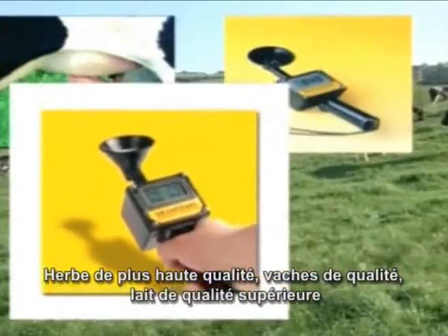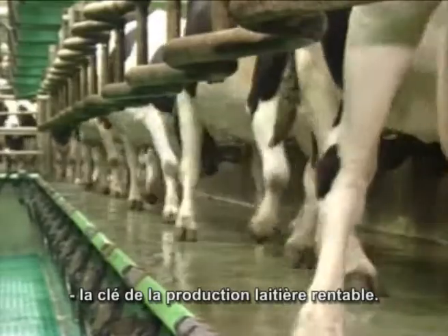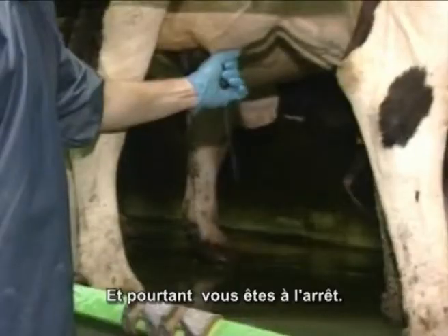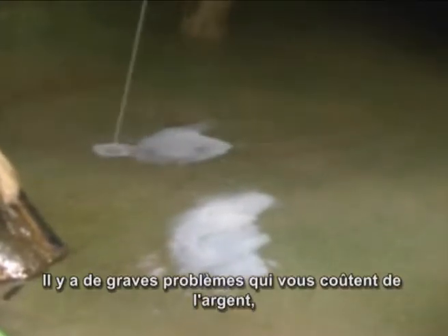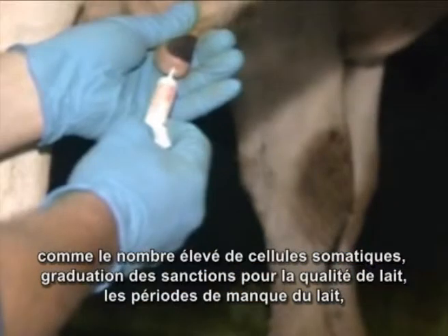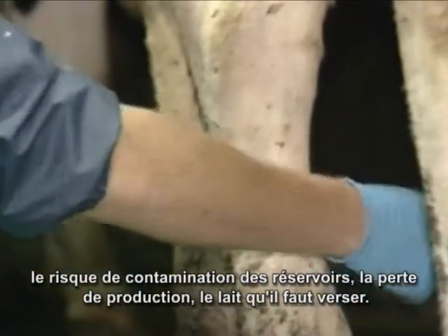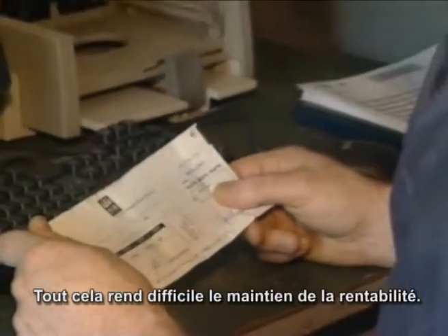Top quality grass, top quality cows, top quality milk — the key to profitable milk production. You're doing everything right, paying attention to every detail, following all the recommendations, but yet there are problems in your milking herd — serious problems which cost you money: high somatic cell counts, tough grading penalties, expensive treatments, withdrawal times, risk of bulk tank contamination, and serious loss of milk production — milk down the drain. All adds up to a very disappointing milk check.